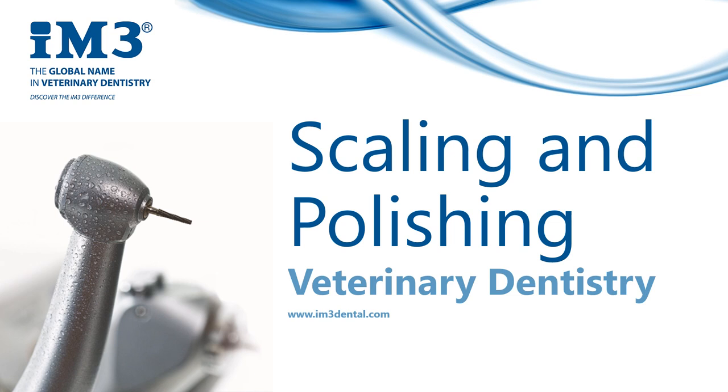Hi everyone, my name is Sarah Cowan and today I'm going to chat about scaling and polishing in veterinary dentistry. Using an ultrasonic scaler with appropriate tips for supra and subgingival scaling, followed by hand scaling, is the most effective way of removing calculus.